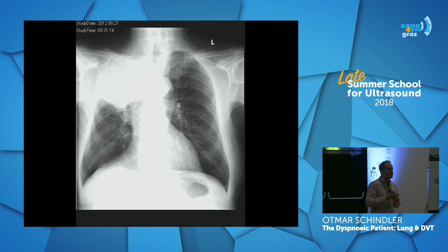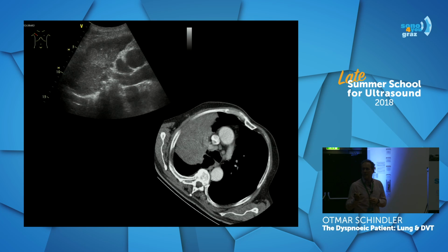What does this patient have? Pneumonia, no. In fact, it was sent to us for a localized effusion. We took the ultrasound probe and we saw it's not a localized effusion. It's big atelectasis, even with some bright spots, so some air bronchogram inside. There is an effusion around it. So that was big pneumonia, post-stenotic pneumonia.